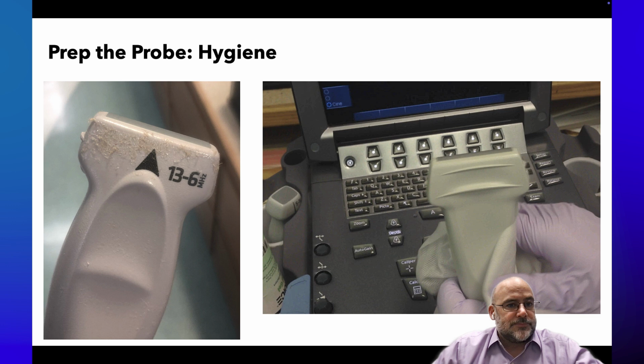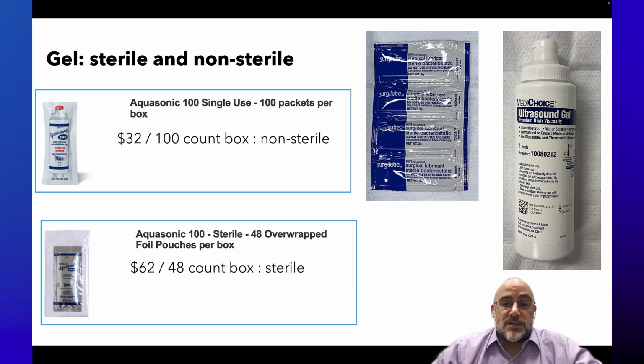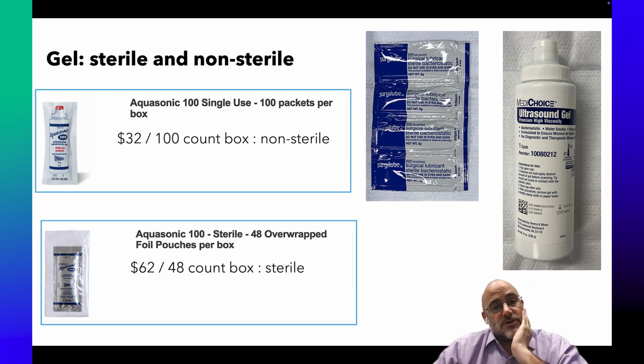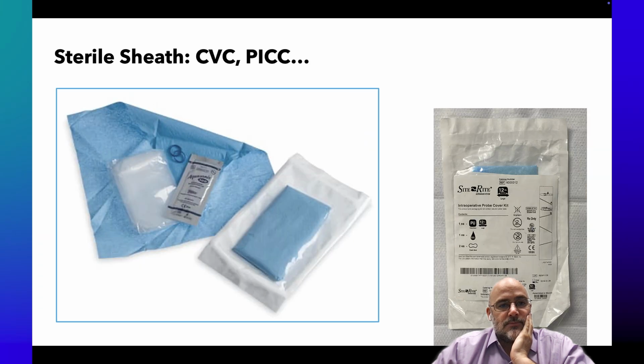Further, for the ultrasound gel that you use for your pre-scan, you're welcome to use the non-sterile multi-use gel bottles if you'd like, just to take a look and make sure your vessels are good. But when you're actually doing the puncture, you want that to be the sterile gel so that there's no question of cross-contamination.